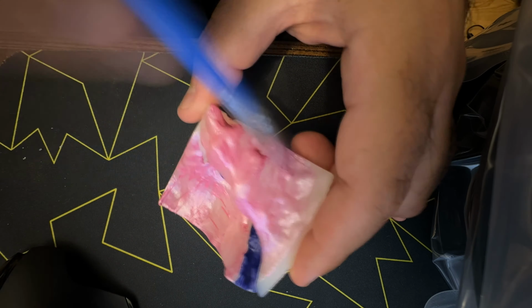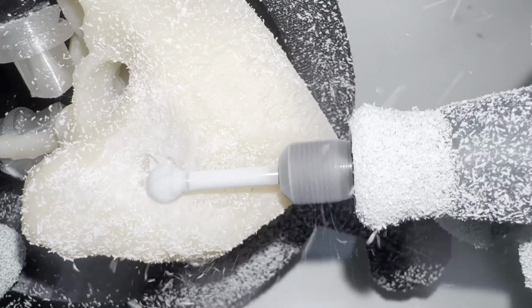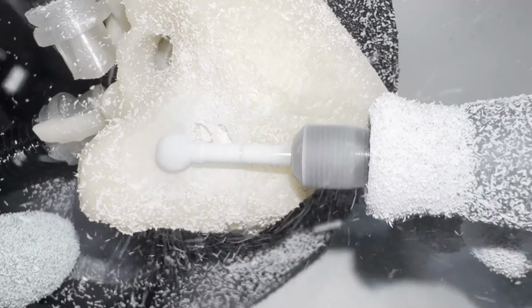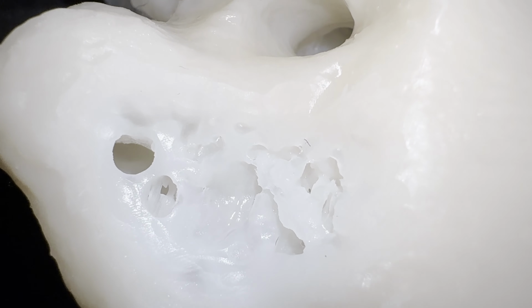This is being drilled at home without a suction and without water. It does make a mess, but if you have a nice box where you can put in this temporal bone holder that's also 3D printed, you can train at home. You can clearly see the mastoid air cells. And after I've cleaned it with water, you can see how it actually looks pretty nice.